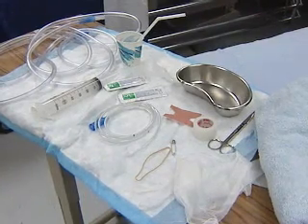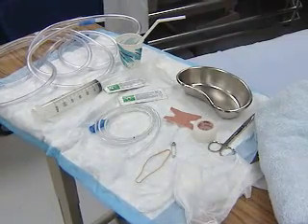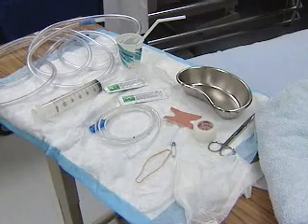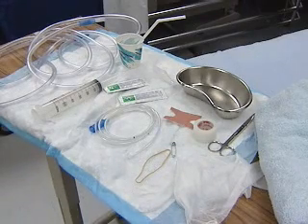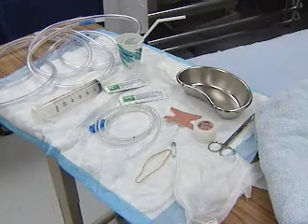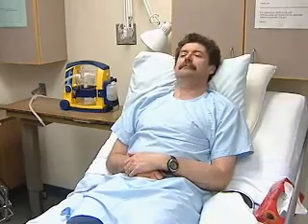You'll need 14 to 16 French gauge nasogastric tubing, water-soluble lubricant jelly, catheter-tip syringe, a suction drainage system, and hypoallergenic tape. Also ready, a glass of water with a drinking straw, and within easy reach of the patient, a towel, tissues, and the emesis basin.